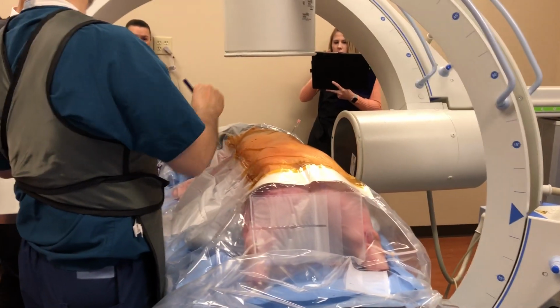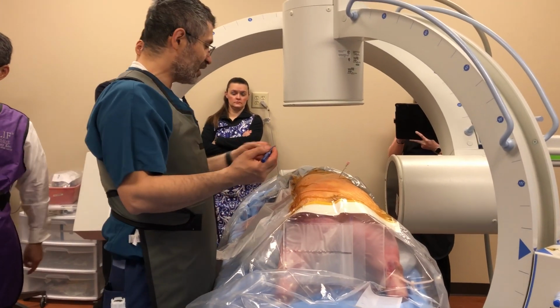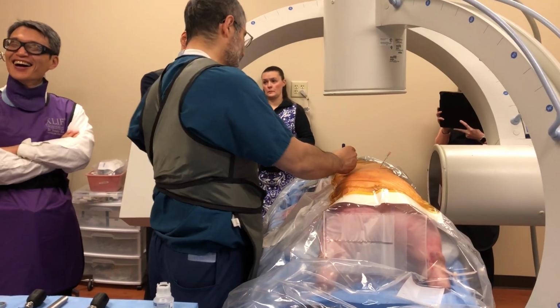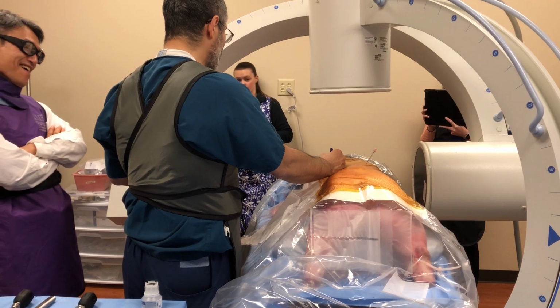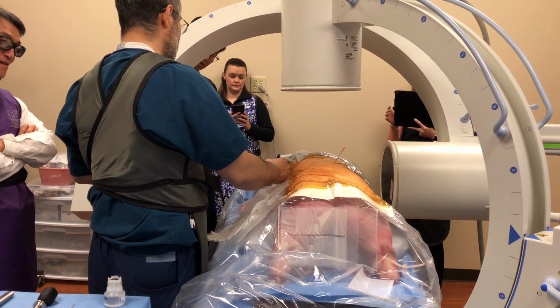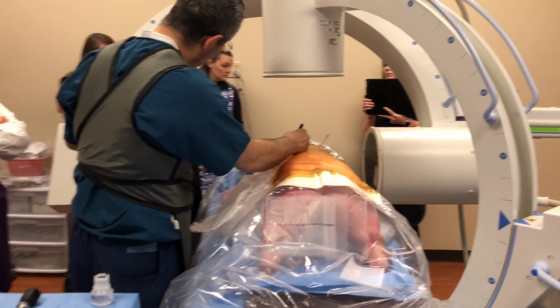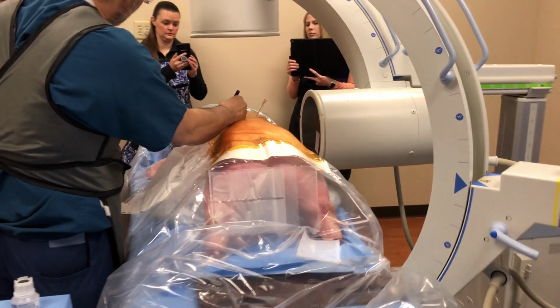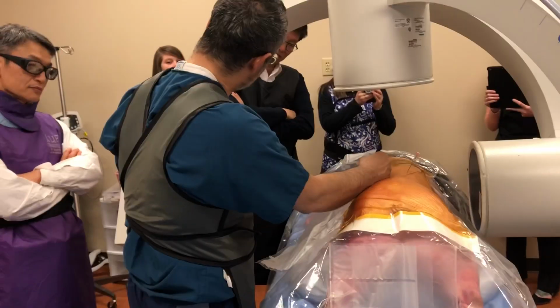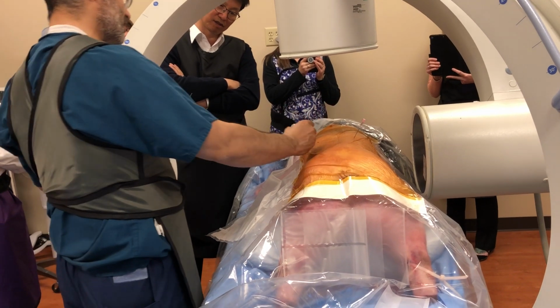You try to do that 45 degree, and that's the best approach for Kambin's triangle. Now, once we have this, depending on how you want to put the cage more anteriorly, you're not going to go more steep. So you go more to that. This is your window. You go here. If you want to put it more to the other side, like with scoliosis, that you want to pass to the other side, you go more lateral.